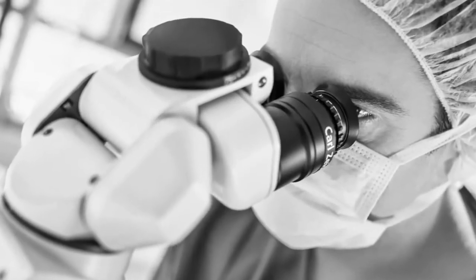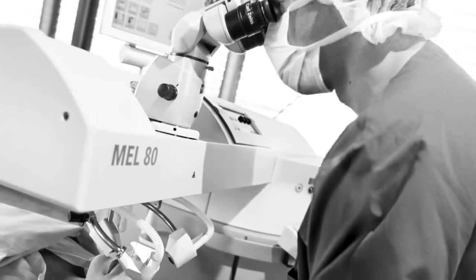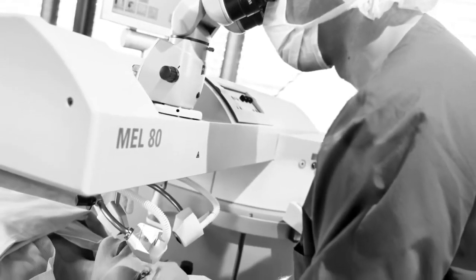Refractive surgeons who already use a CRS Master and a Mel-80 Ximer laser can immediately expand their LASIK repertoire and increase their patient base.